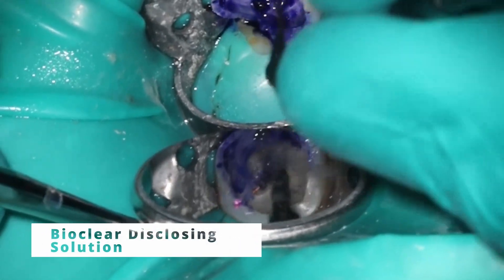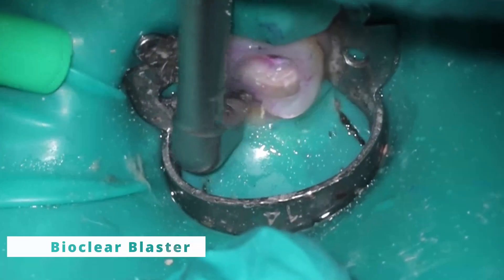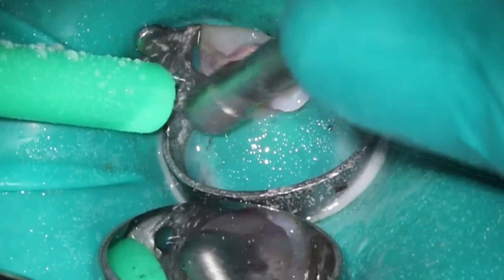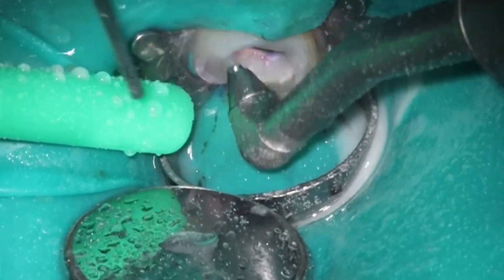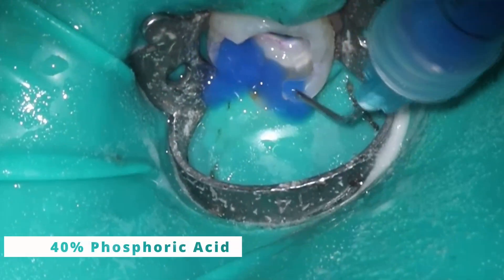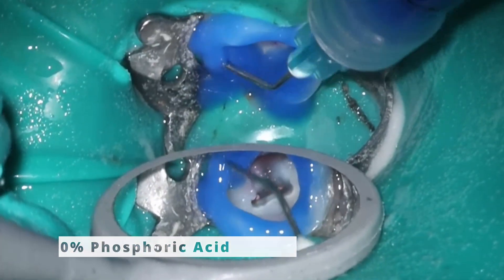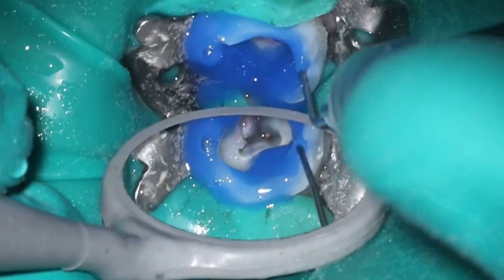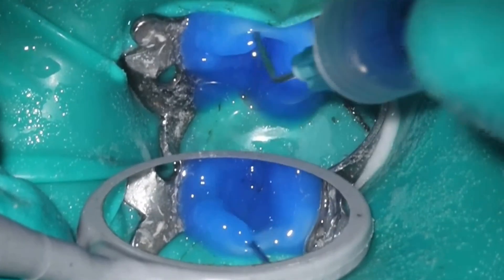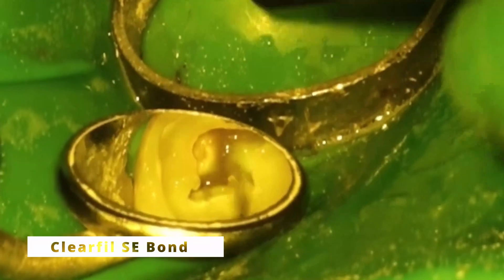We're going to do a traditional buildup here. This patient is old enough that they're going to go ahead and get the crown done right after, so I'm not worried about making it full contour — just enough that it's cleansable. This is one of those really good cases to show why I use the disclosing agent, because there were spots where there was no bacterial activity at all, and there were spots where there was actually a lot more than anticipated. When I do the buildups here, I always start with the enamel. It's better to have a little bit of a longer etch on enamel and then a shorter etch on dentin. And you can clearly see how that distal lingual is more to the lingual — this tooth is not symmetrical.